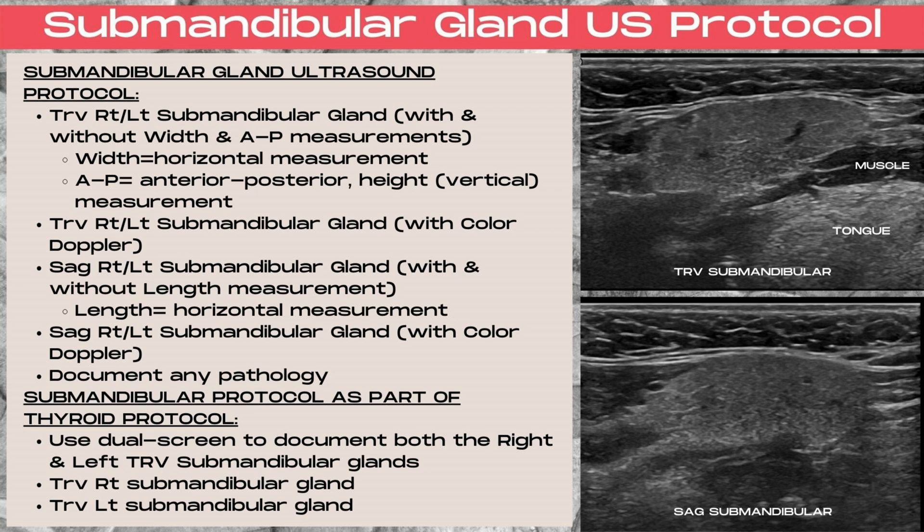Next, move to the sagittal plane — a sagittal right and left submandibular gland with and without length measurements. Note that length is a horizontal measurement on the ultrasound. Then sagittal right and left submandibular glands with color Doppler as well.